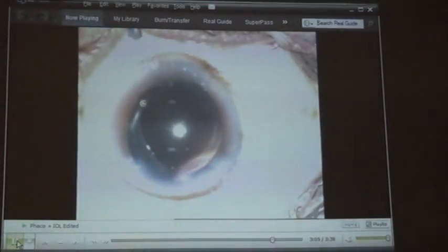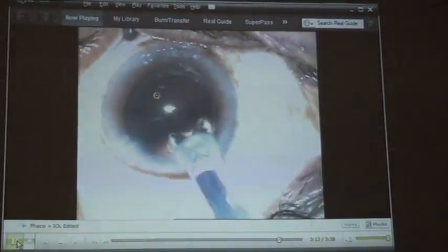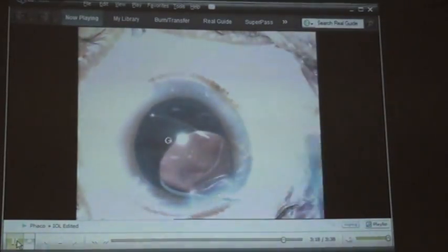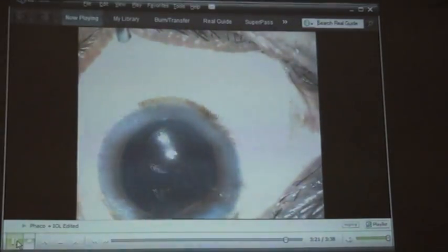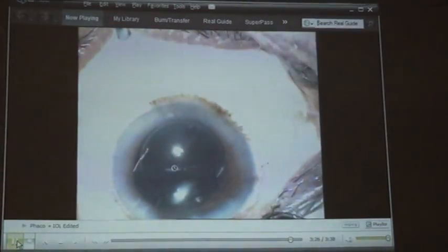The complete circular opening of the anterior capsule is nicely visible. Now the IOL implant. Actually this is the platform, the posterior capsule on which the intraocular lens is supported, and it is placed within the bag that has been created by making an opening in the anterior capsule. That round shaped circular opening is visible. And the IOL is getting implanted within that bag. So behind the IOL is the posterior capsule, and anteriorly at the margin is the anterior capsule, and at the center it's a big opening. So now this IOL is placed.